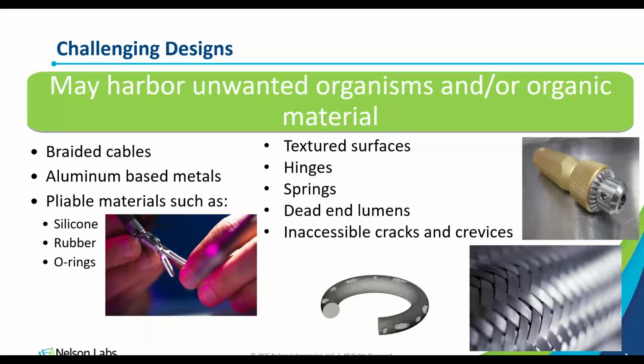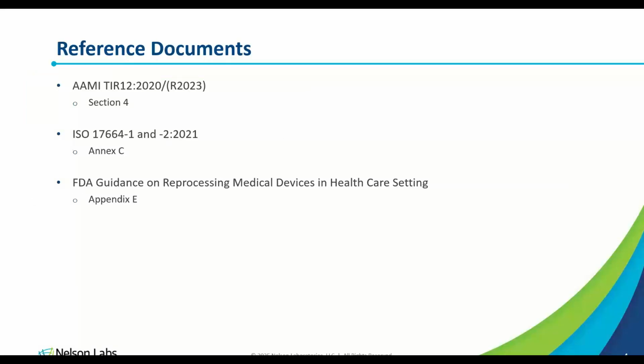And so that's where, just referencing this list, you can also look at these reference documents. So AAMI TIR 12, Section 4, ISO 17664-1 for critical and semi-critical devices, -2 for non-critical devices, Annex C of that document. And then Appendix E in the FDA guidance on reprocessing medical devices.